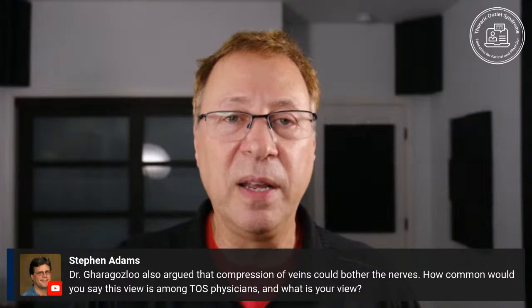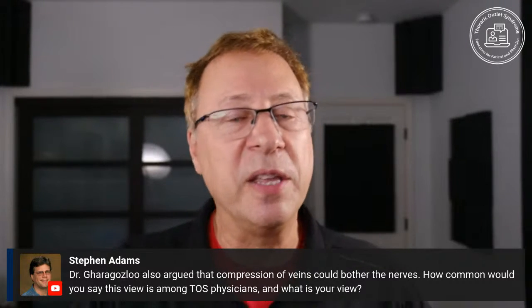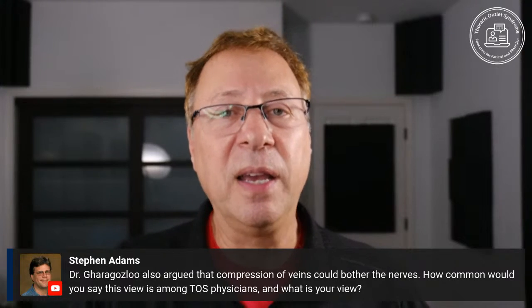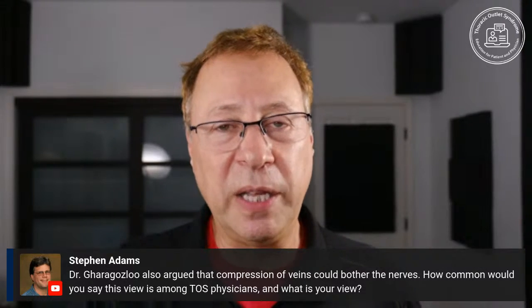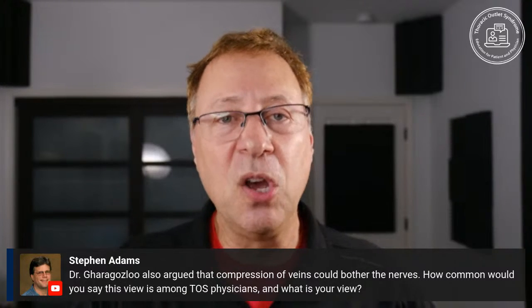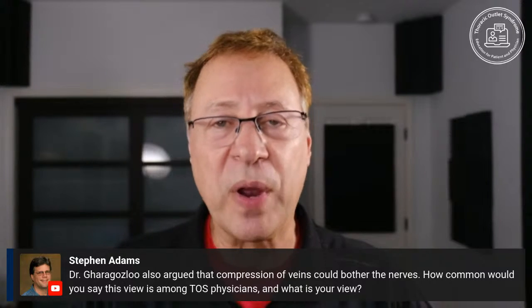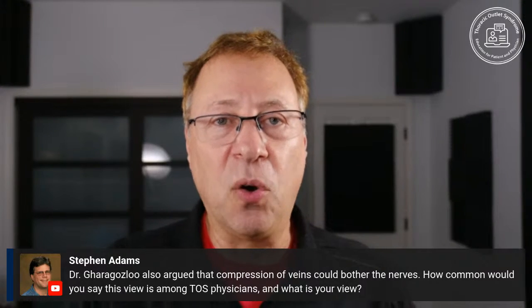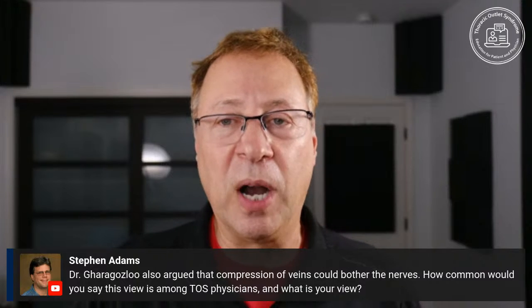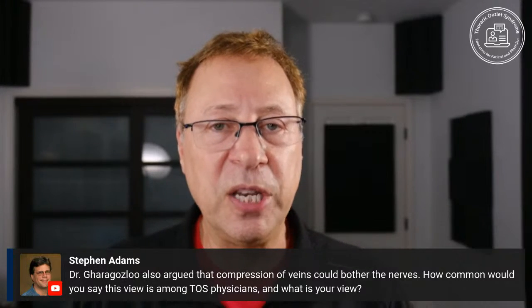Now, we don't know the numbers. We haven't done research on this to prove it yet. It will be challenging, but a lot of docs in the field just see the direct compression effects. My opinion, which is supported by some of the literature, is that there is evidence that venous compression by itself can either cause or contribute to those other findings of compression or stretching. And therefore, we need to always be looking at the veins. That's what we do with our MRI. No matter what we see on the brachial plexus, we always describe the veins. And those need to be treated if there's the clinical finding of TOS.